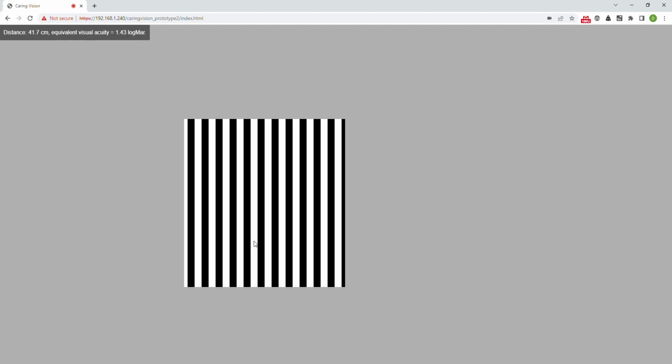So the number of black bars will increase gradually over time. If you look at the top left-hand corner of the screen, you'll also notice that it's measuring how far away I am from the screen as well. That distance relates to the distance from the webcam to my eyes. And again, if I move backwards a little bit, you'll see that the number increases. And then I move forwards again, and the number goes down.